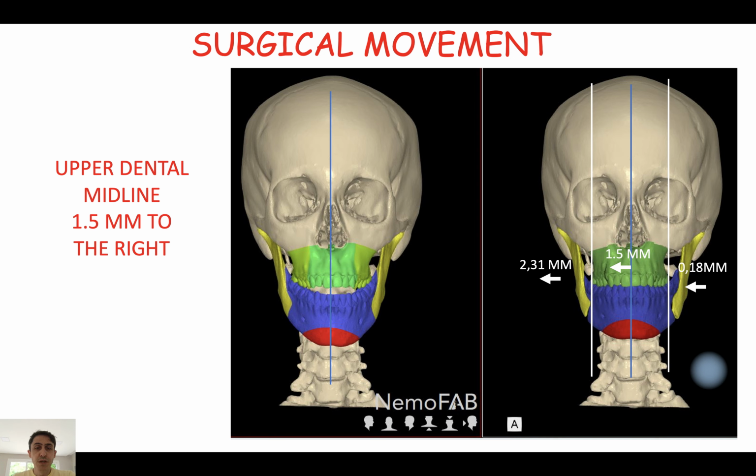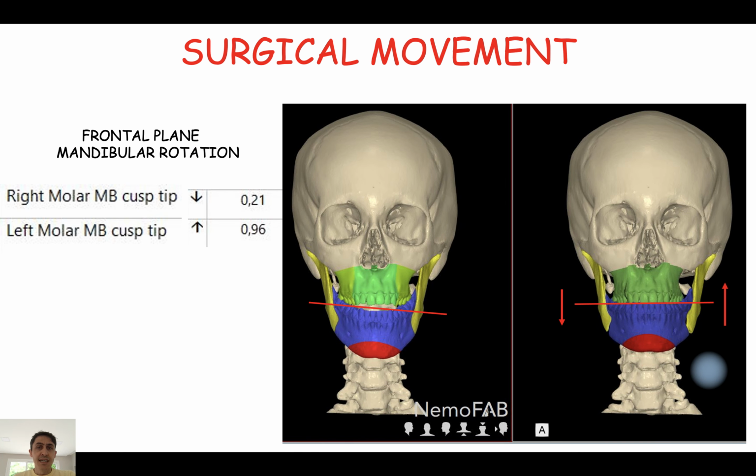In the frontal view, you can observe here the correction of the upper dental midline and some correction of the maxilla, which, as our head orientation showed, is necessary.